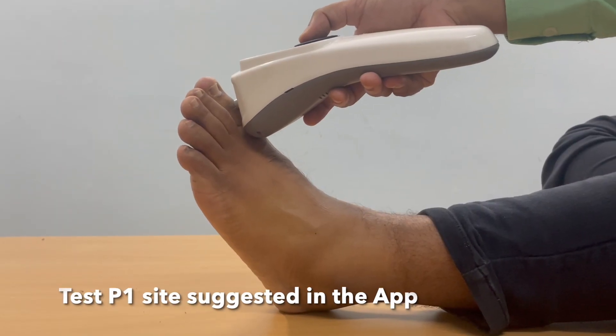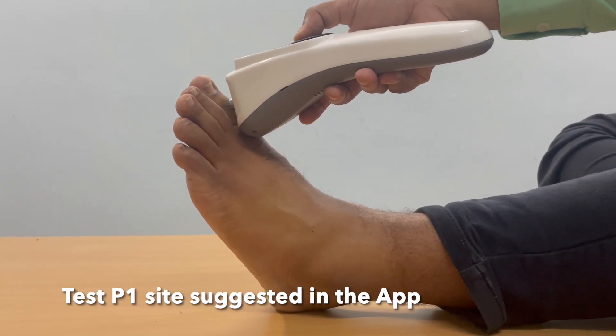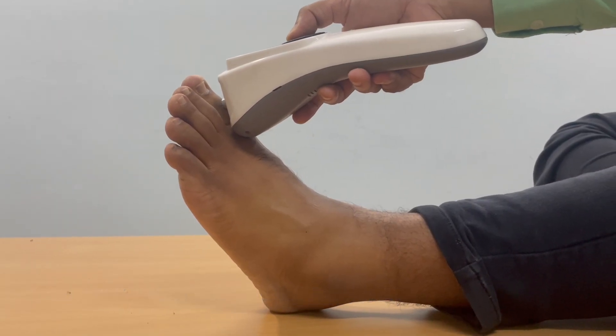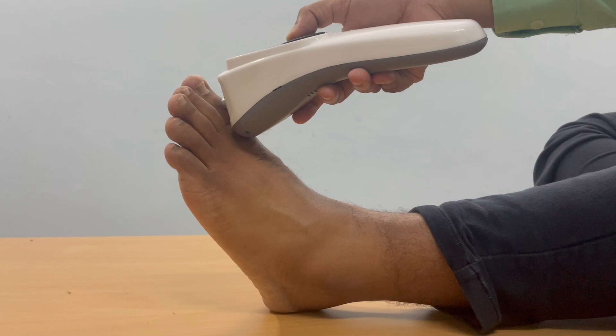Proceed to test at the selected position P1. Place the probe on the testing point P1, ensuring that it is perpendicular to the skin surface and gently touching it. Instruct the patient to indicate when they feel the buzzing sensation.